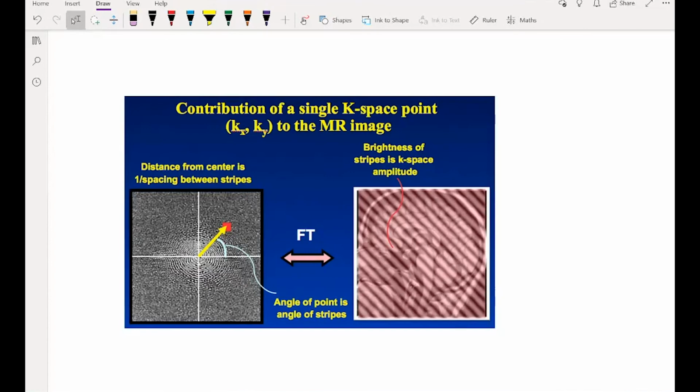And what spatial frequency means is, instead of having that signal wave with its ups and downs, like you might see on a radio wave or something like that, a spatial frequency in an image is a change between dark and light and dark and light and dark and light, as you can see in this red overlay. Okay, on the MRI image on the right side, there's this transition between dark and light and dark and light, and that's the spatial frequency.